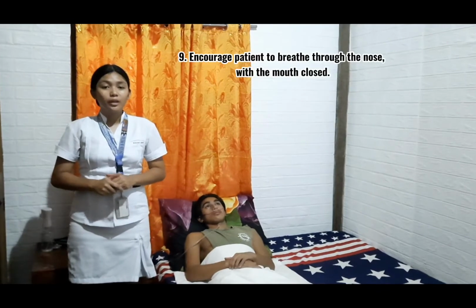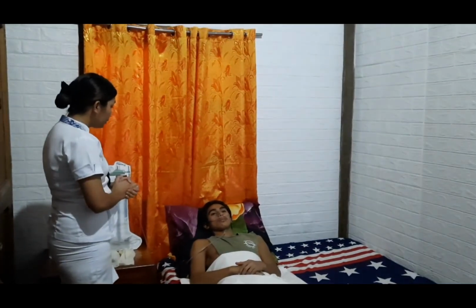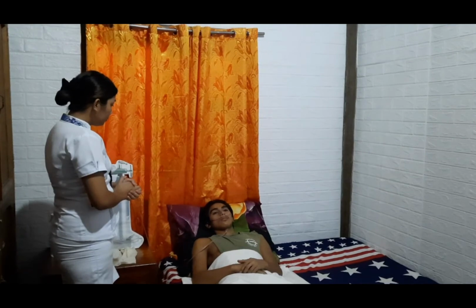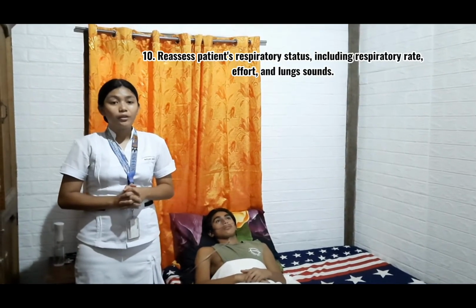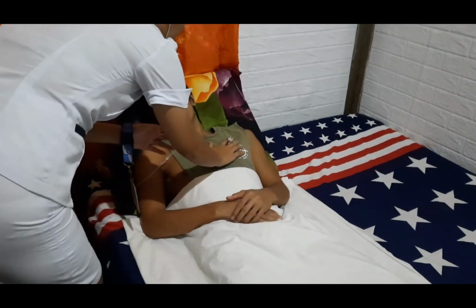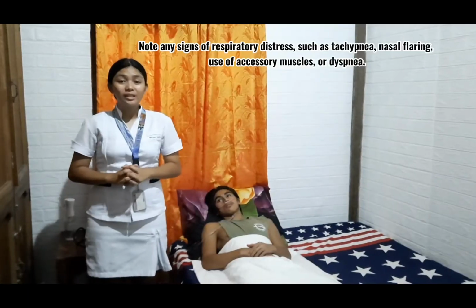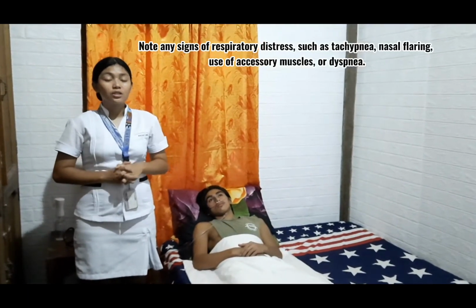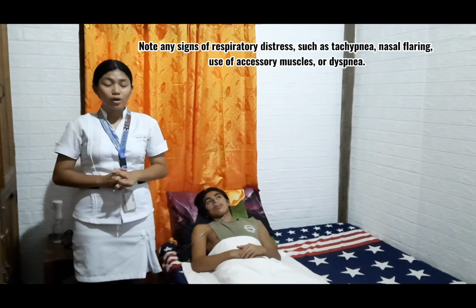Next, we need to encourage the patient to breathe through the nose with the mouth closed. Sir, please breathe through your nose and close your mouth. And then next, we need to reassess the patient's respiratory status, including respiratory rate, effort, and lung sounds. Note any signs of respiratory distress, such as tachypnea, nasal flaring, use of accessory muscles, or dyspnea.